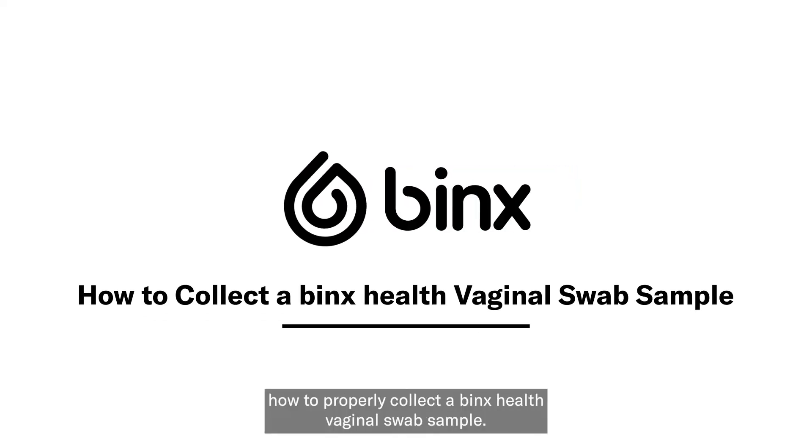In this video, we will walk through how to properly collect a binx health vaginal swab sample.